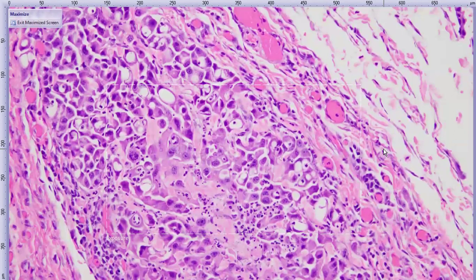And this neoplasm is showing an extensive carpeting of intraocular surfaces and a multifocal distribution, in that there are random foci out here in the conjunctiva, as well as the populations inside the eye. This pattern of distribution is highly suggestive of a neoplasm metastatic to the eye from another site. The other thing is that this morphology of cells isn't really consistent with anything that tends to form as a neoplasm inside the eye from local tissues, which is also helpful to make a diagnosis.